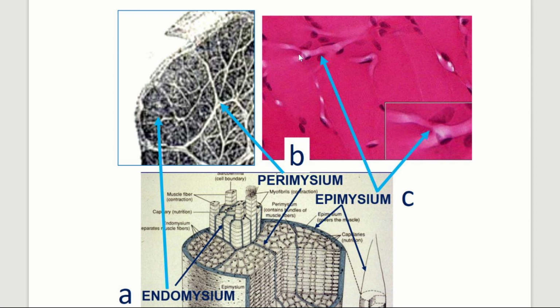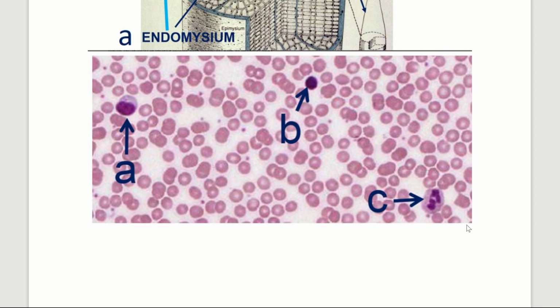And then this right here, what this is depicting, so this is skeletal muscle. These are the blood vessels, the capillaries that run through skeletal muscle. Okay, so this would not be depicting the connective tissue that runs around the entire muscle. Okay, this is a capillary, right, in individual muscle cells. So that would not match. That is not epimysium.